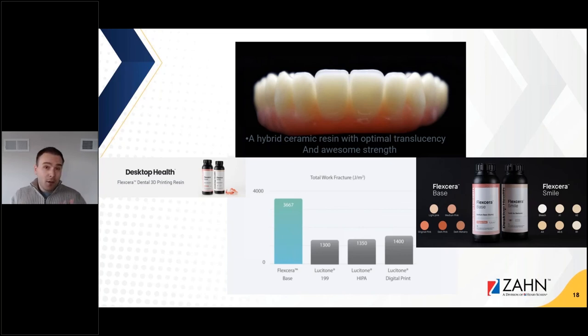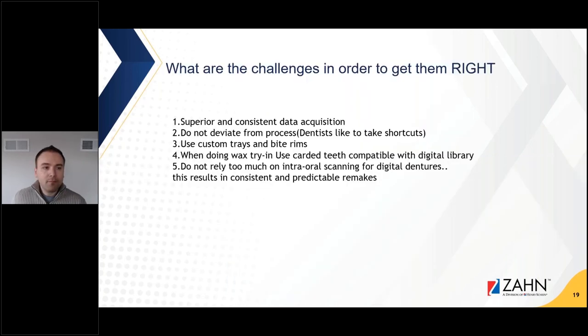Whatever new comes to the market, we don't have a preference. If it's good, we're going to want to use it. But before we make sure that we can use it, we're going to want to test the bejesus out of it. This is something we've been working on, and other companies are also coming out with their offerings. So just be on the lookout for these new denture 3D printing resins coming to the market. But that's pretty exciting. And so what are the challenges in order to get digital dentures right?